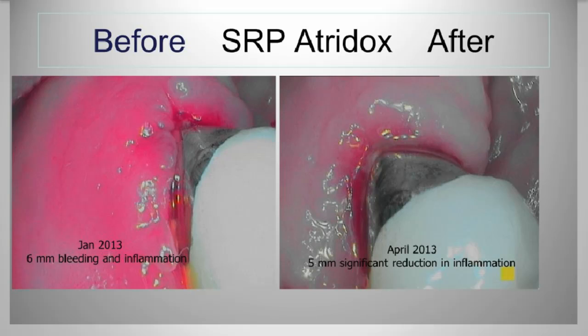This is pretty exciting. I'll tell you, this is probably the most valuable lesson I learned in using this technology. It's a little bit of a story, but I think it's worth sharing. As you know, my focus is non-surgical periodontal therapy. To explain what I have on the screen here, this is my patient, she's 85 years old, wears an upper partial, and had a 6-millimeter pocket right there, just straight on. I can't remember the other pockets, to be honest with you.